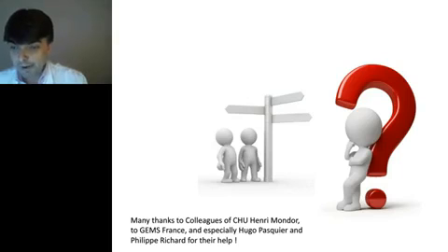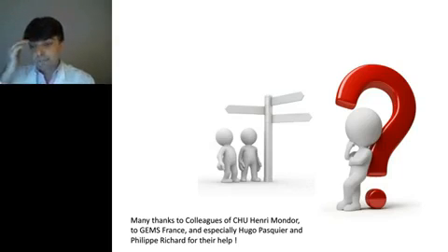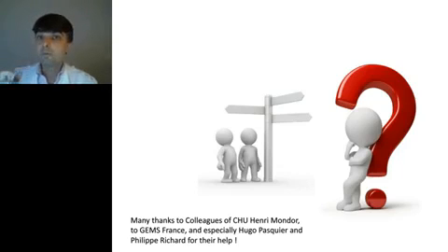A question here, can we reduce just to one phase of acquisition? My understanding, of course, is that the question is, could we just rule out totally the non-enhanced phase? My answer is yes, if you do not need to measure specifically a Hounsfield unit number, where you must be very strict in the way that you can analyze that Hounsfield number. So, for instance, for adrenal glands evaluation in CT, my answer would still be cautious.